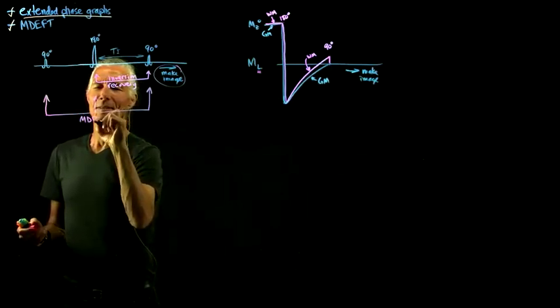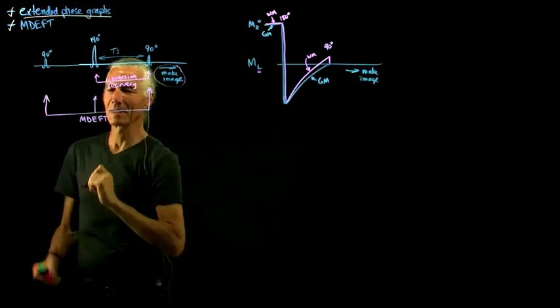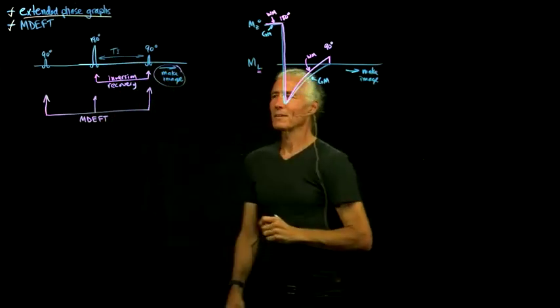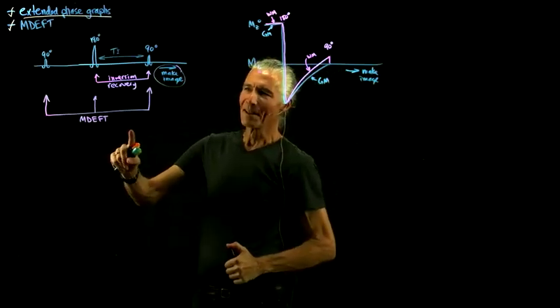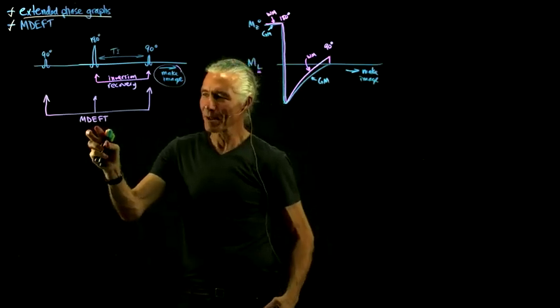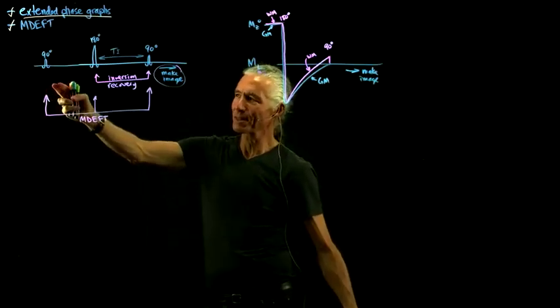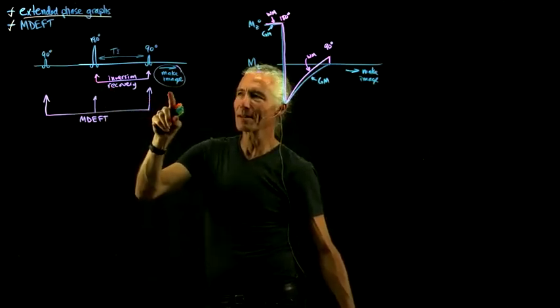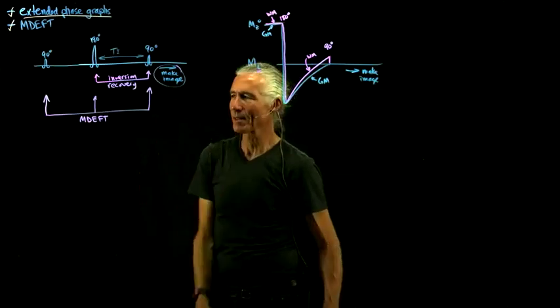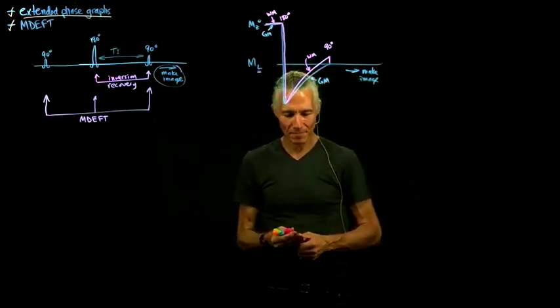What it means is something like, the F-T means Fourier transform, and magnetization something, Fourier transform. Unfortunately, we have all these acronyms, but they just become words, and the meaning of MDEFT is two preparation pulses before you do the 90 that you make the image from. And so what's the point there?